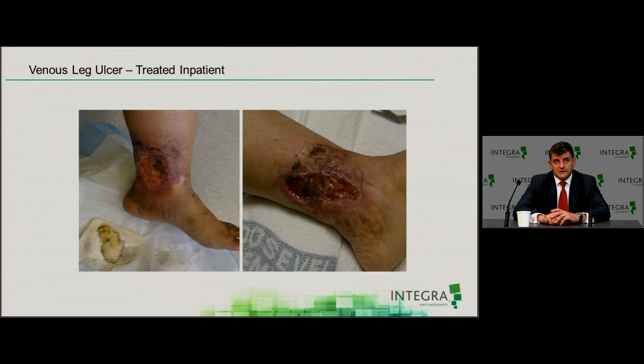For venous stasis patients, they often have too much pain to really get rid of their damaged dermis. You know, we're talking about IDRT therapy, so we're talking about regenerating dermis. So those patients will often be taken to the OR where they can have adequate analgesia. Now this patient, if you took this patient and tried to treat them as an outpatient, they'll never heal. The data on that doesn't exist because these wounds are bigger than patients usually have articles written about them. Take them to the OR, debride them, place IDRT therapy, their pain goes down significantly, we regenerate a dermis, and then we'll often use a secondary procedure to close them with an epithelialization strategy.